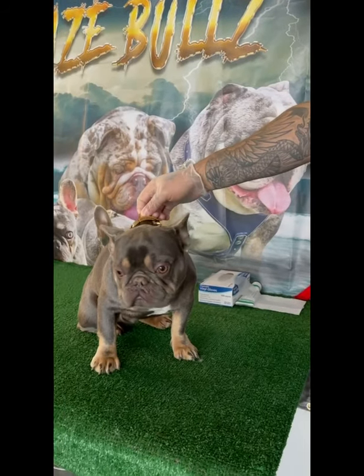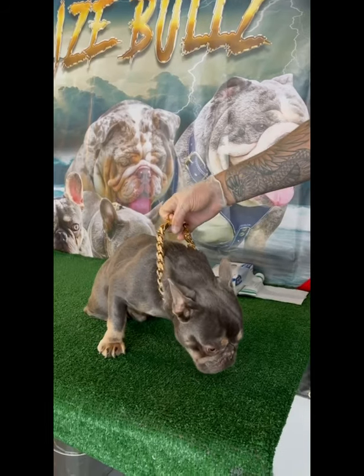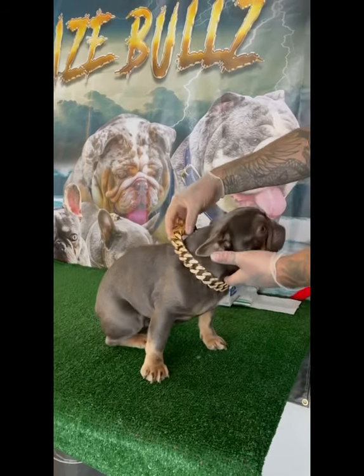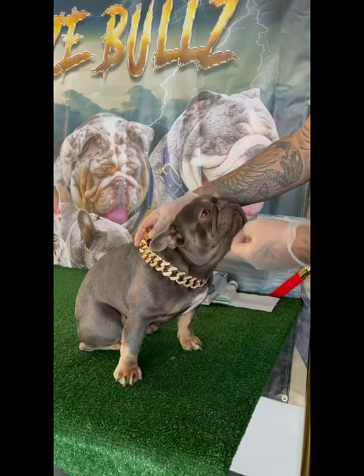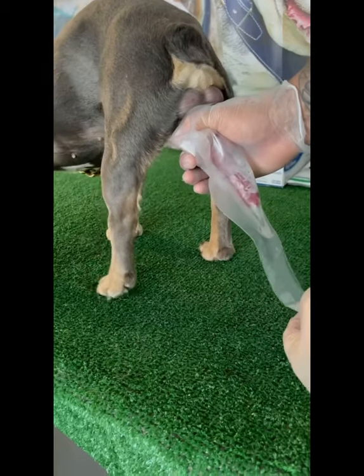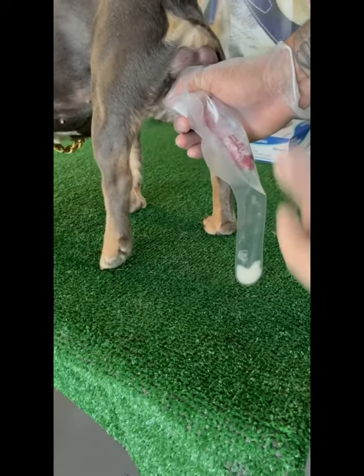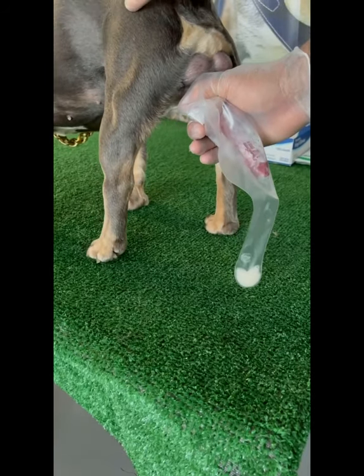Next step: getting your semen collected. Today's volunteer is going to be Purple Punch — he's always very happy and grateful for the opportunity. Collection is in process. What I did is I pulled him back, held on to his ring and he did his thing.